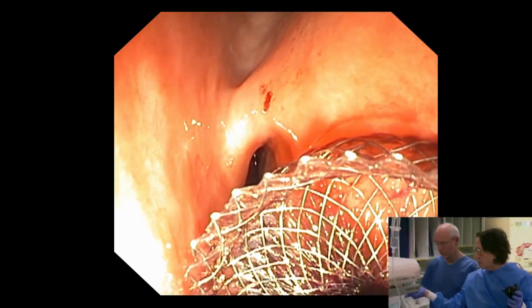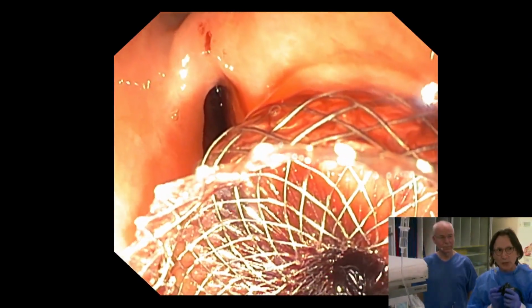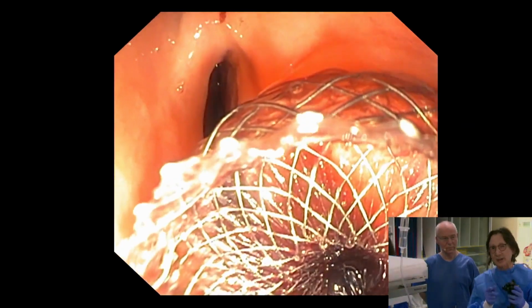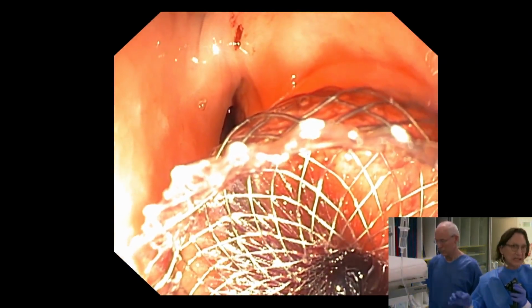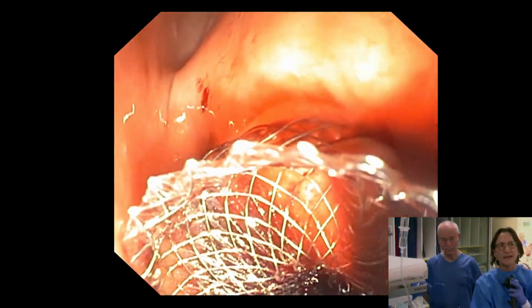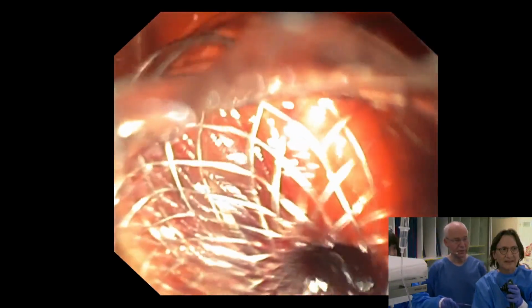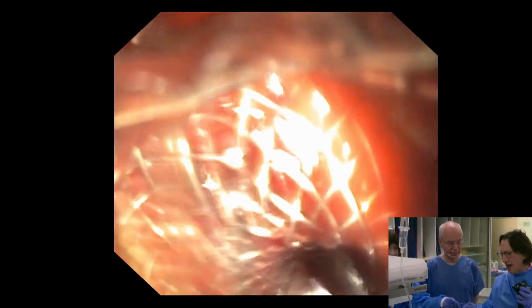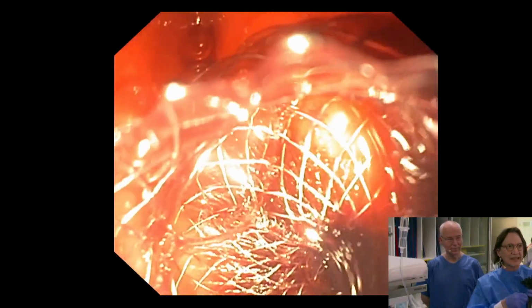Now we're going to dilate the lumen with the CRE balloon. We're going to use a 15 to 18 CRE balloon, and we're going to dilate up the saddle. I'm also going to aspirate some fluid. We can put a trap on, collect that fluid and send it off for analysis. But you can see already that the fluid looks a little blood tinged, doesn't it? Yes, as you expected. There was bleeding into the pseudocyst. So now Hannah has handed me the CRE balloon, and now under direct guidance, I'm going to pass the CRE balloon into.